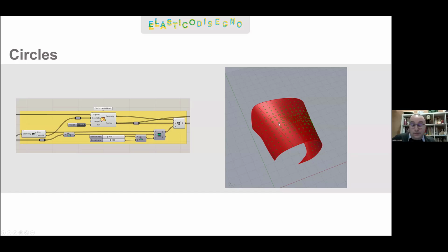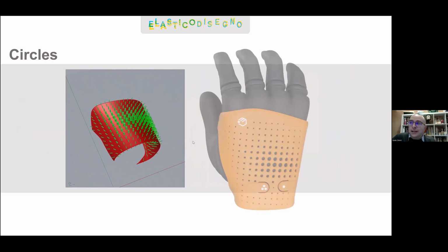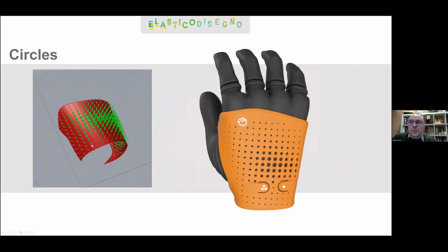At this point, we had to start making these holes in the cover. So to do that, we needed some cylinders that we could subtract from the cover surface. But in order to do that, we needed to be able to extrude every circle perpendicular to the surface. And so we used Grasshopper again to extract the center of the circles, together with their normals, and then project them onto the surface, obtaining this way this series of cylinders, which we then scaled along the z-axis to make sure that they went all the way through the cover, creating what we call the porcupine, which was then brought back into Creo to punch holes into the actual covers.